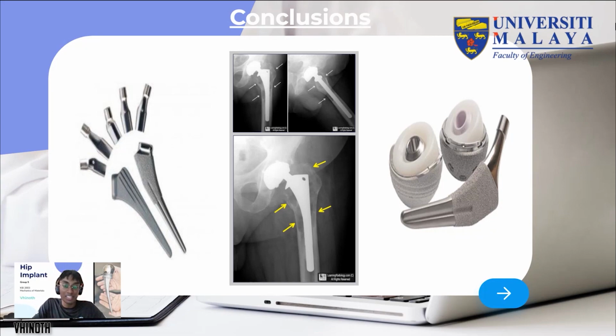The proximal region of the stem is coated with pure HA over a commercially pure titanium plasma spray substrate. Though it is far from being completely sustainable and fully perfect, this model of hip implant is the best in the market currently, hence being the best seller worldwide. With the technical possibilities currently offered by materials and prosthesis engineering, the need to consider individual variation in hip anatomy is gaining recognition among the orthopedic community.